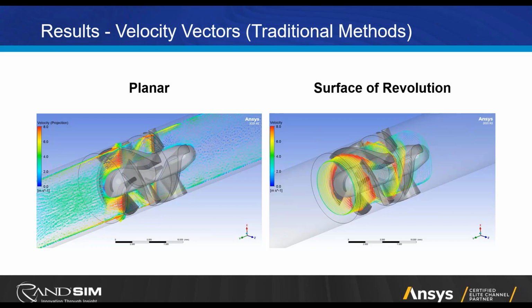So you can get a little bit smarter and do something like you see on the right there, where you can create this surface of revolution, basically slice the model with that, and then put the vectors on that cylindrical surface. So it's a little better. You can get a better idea of what's happening in the blade passage. But still, it's a 2D phenomenon you're trying to evaluate, but looking at a complex 3D image. So Ansys has tools that help you with this as well to make that easier. Next slide, please.